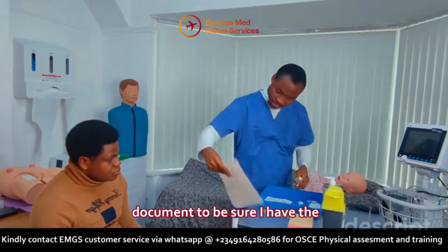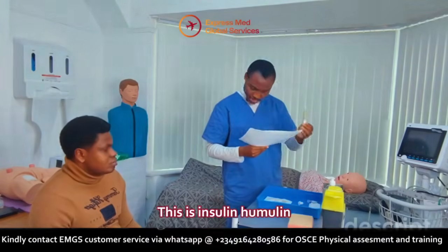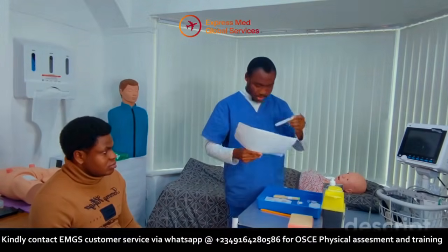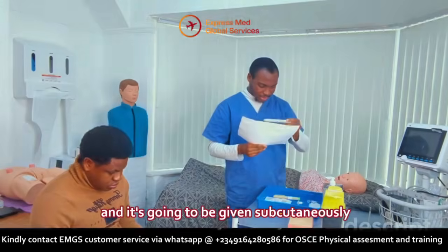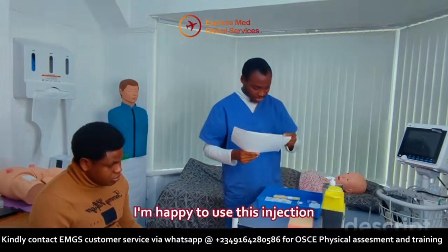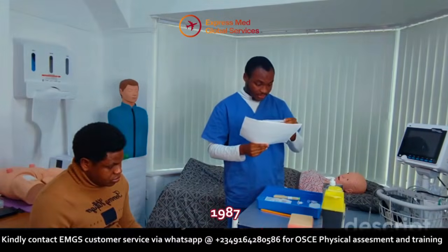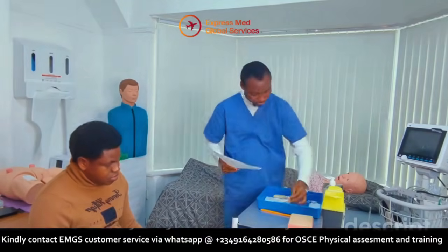I have to cross-check my document to be sure I have the correct insulin. Is it Humulin? No. What is prescribed is insulin. Alright, I have here with me the insulin. I'm going to be giving it subcutaneously. Expiry date is on the 31st/8/2026. I'm happy to use this injection. I can see the label with the date of birth, which is on the 10th/1st/1987. I can confirm that this is for the patient and I'm happy to use.